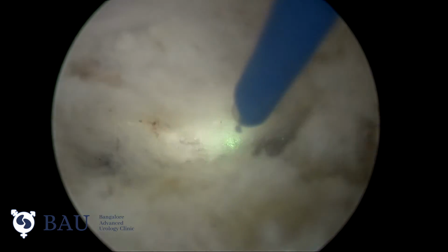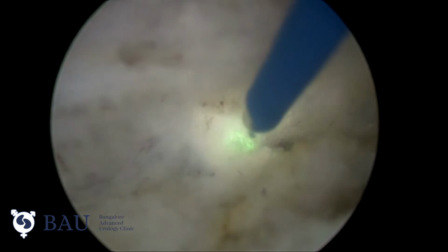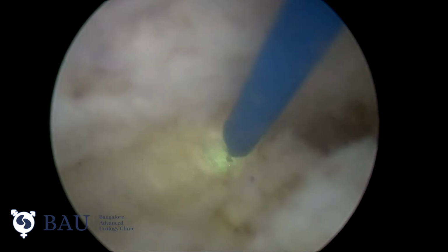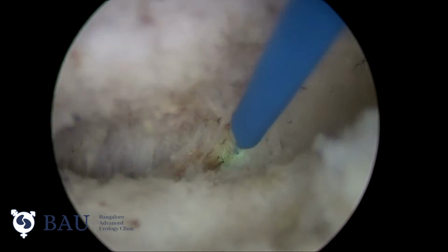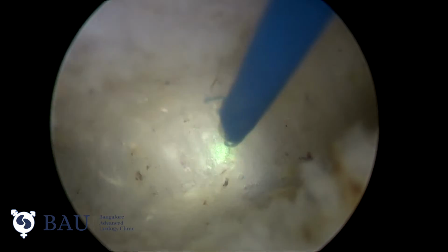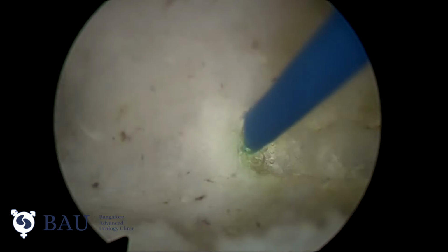Here you can see the capsular fibers. We have to connect the two planes laterally.